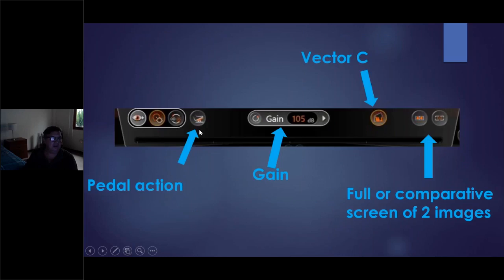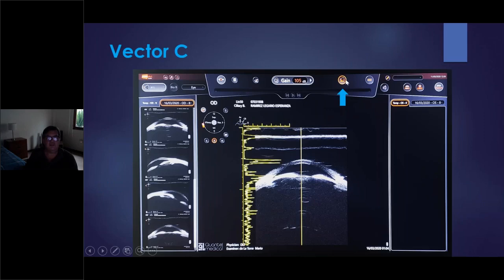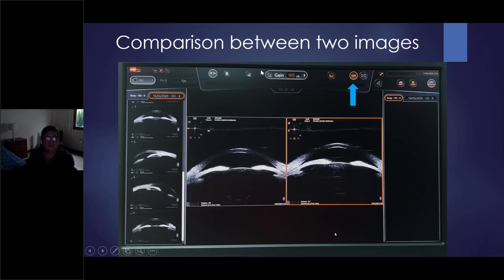You have the pedal action even in the screen. You have the gain. You can have the vector C. You make a full or comparative screen of two images. Let's see. If you push here, you have the vector here. Then if you put this, it is the comparison between two images, and then the full screen, the two images.